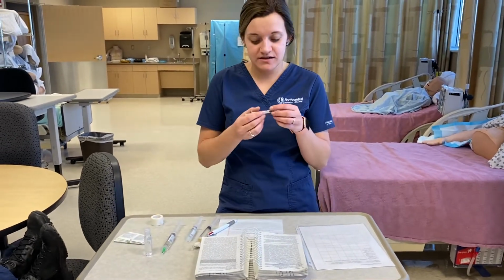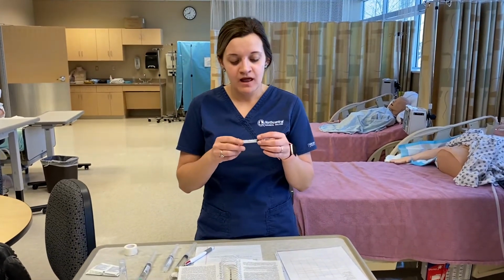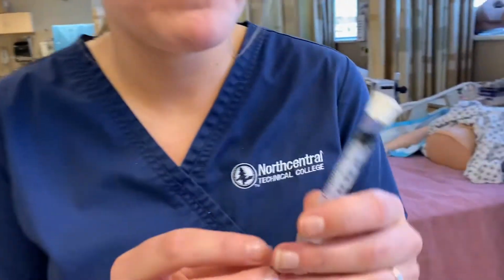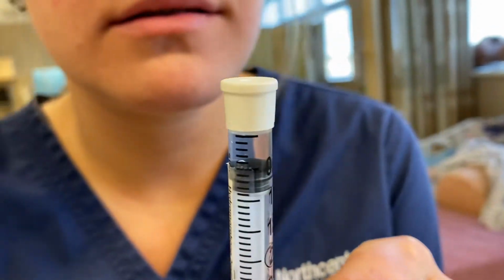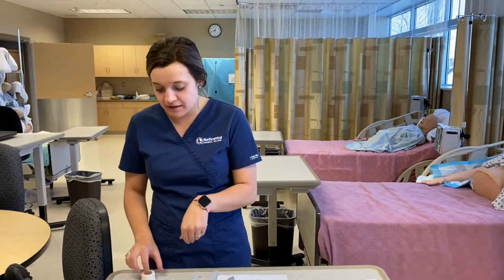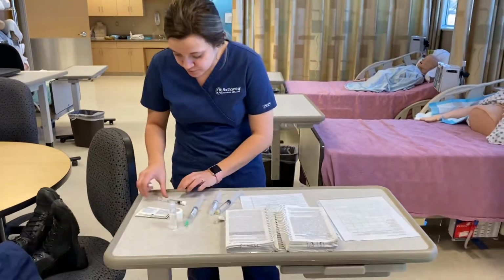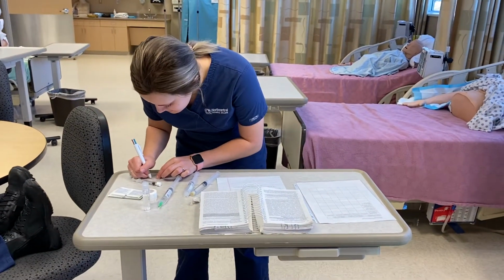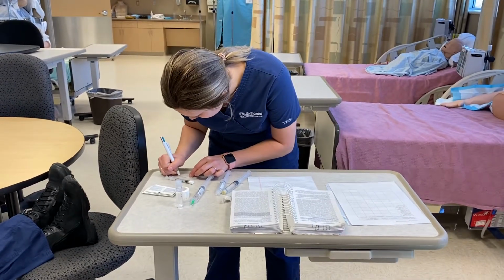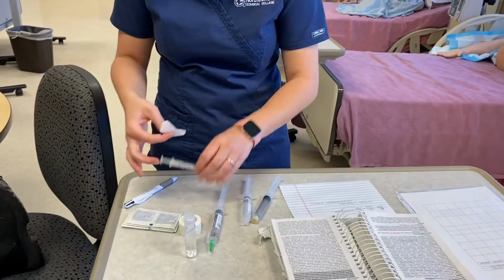And so I did get dose accurate. So for every 2 milligrams per ml, I need to give 0.5 mLs to get that 1 milligram. So if you look here, I'm dose accurate, 0.5 mLs. So what I'm going to do is label that so I know as I bring it into the room. Bob Owens, 0.5 ml per 1 milligram. And I'm just going to stick that on my syringe.